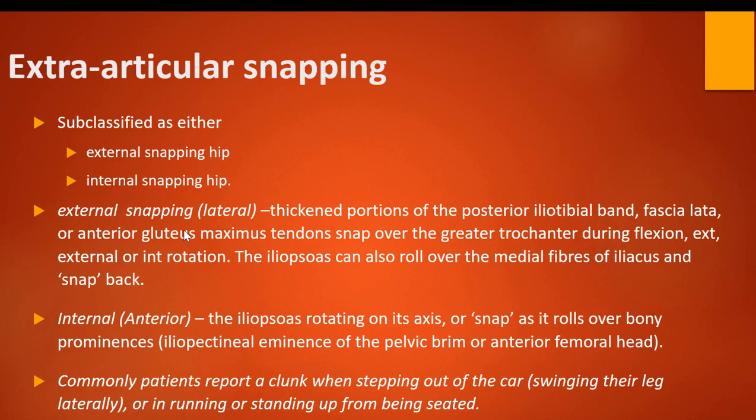In terms of the intra-articular causes, there are obviously loose bodies, so little bony fragments that can float around inside the hip joint.